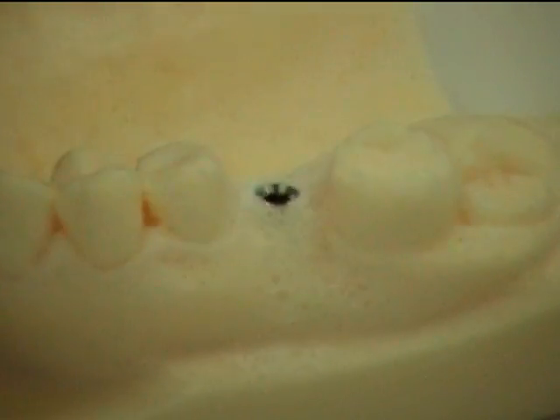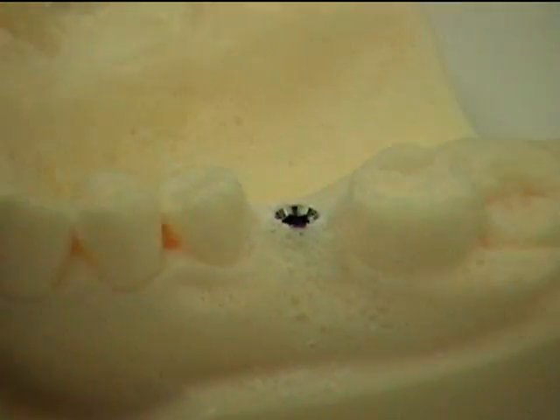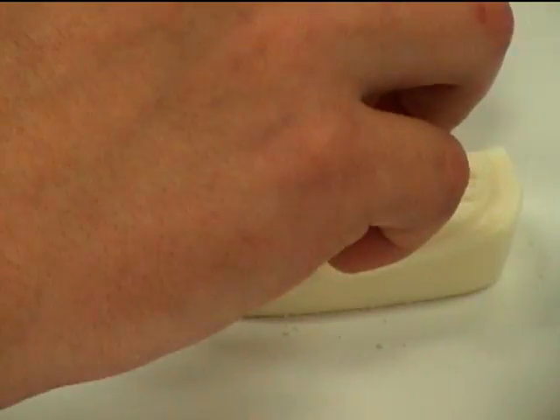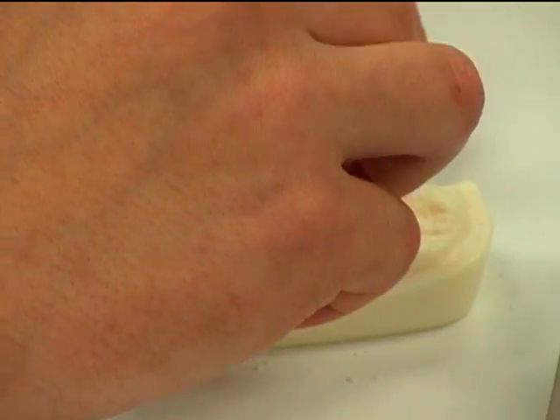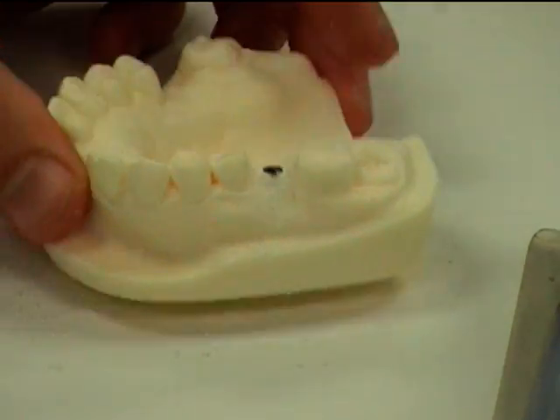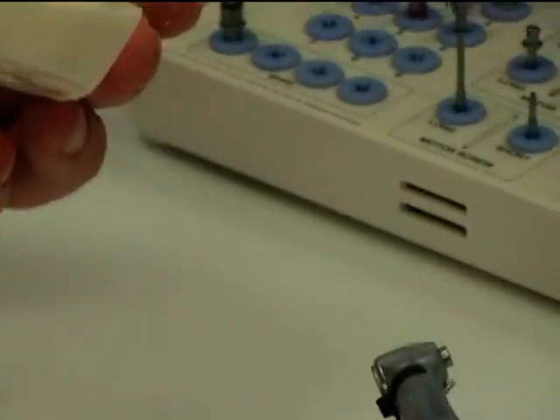And then use the same hex driver to remove and insert the cover screw located on the opposite side of the implant packaging. Implant with cover screw.